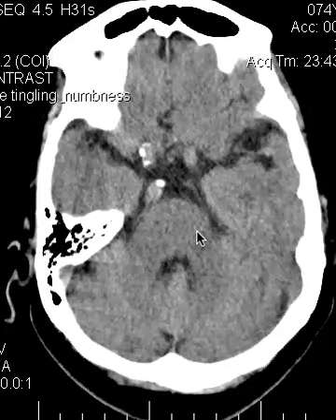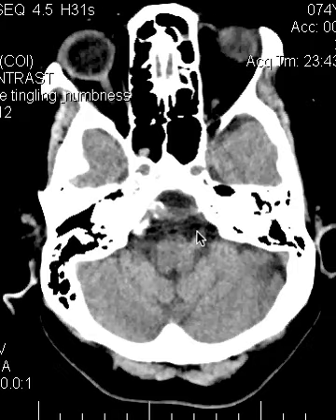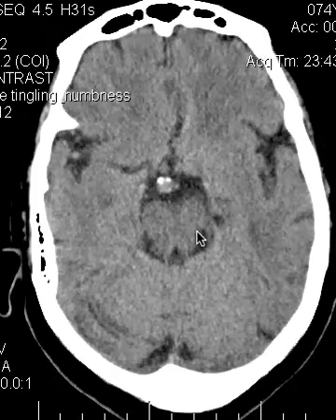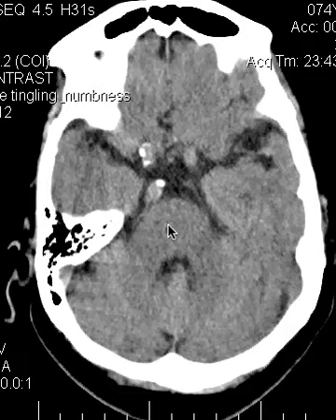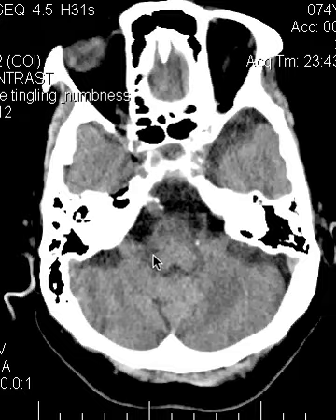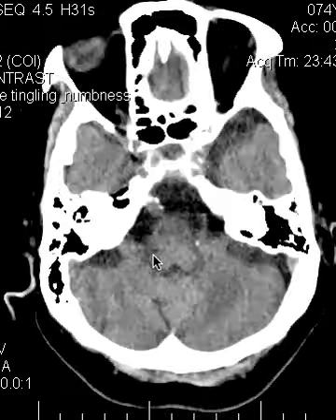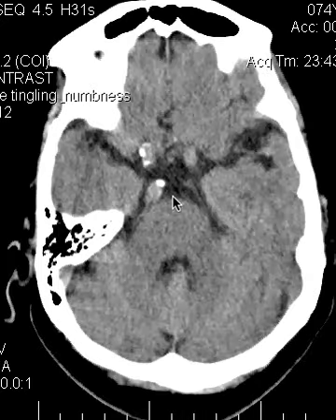Okay, so here's an example of knowing the anatomy, allowing you to make the diagnosis. Because ordinarily one would look at this and say, oh, there's a tortuous basilar artery, it's a little prominent, but I don't see any tumors or infarcts of the brainstem or anything like that that would cause facial numbness. So it's purely by means of knowing the anatomy, purely because we know where that trigeminal nerve comes out, even though we don't see it, that we can make the diagnosis.